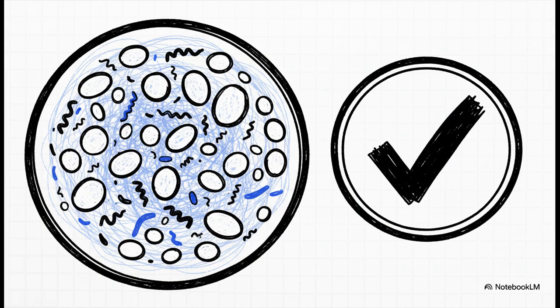The microscope tells the whole story. It confirms everything we suspected. We can literally see the culprits, the bacteria, and we see the body's response, this massive flood of white blood cells, a condition we call pyuria. The diagnosis is now crystal clear. This patient has a major urinary tract infection.